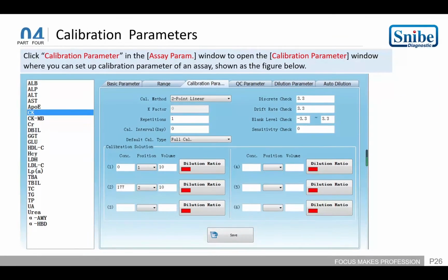Another one is the calibrated parameter. For this parameter, you do not need to change it, and the measure is the same as the basic parameter. The other things you do not need to change; we will give you more introduction in the SOP PowerPoint for this interface.